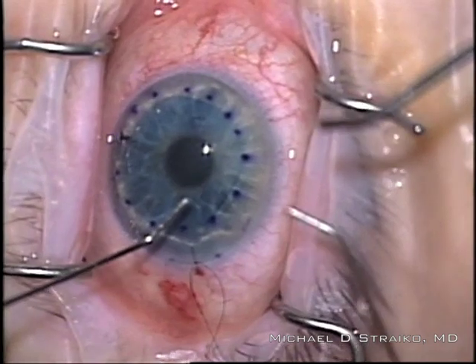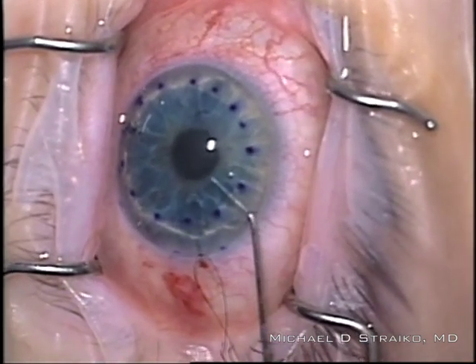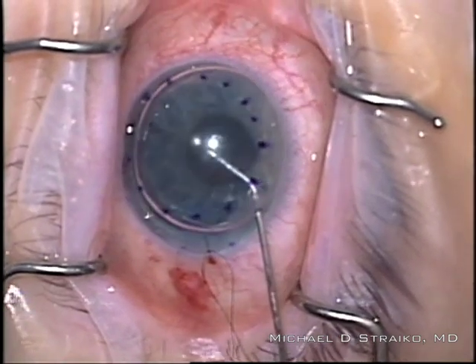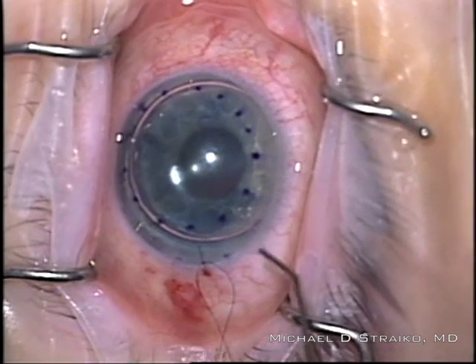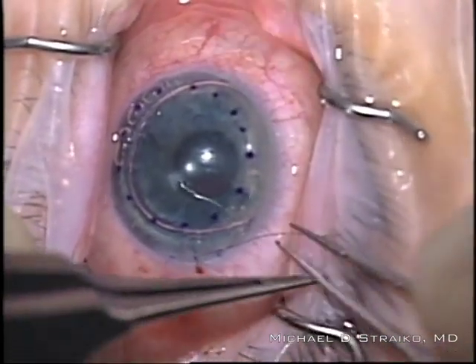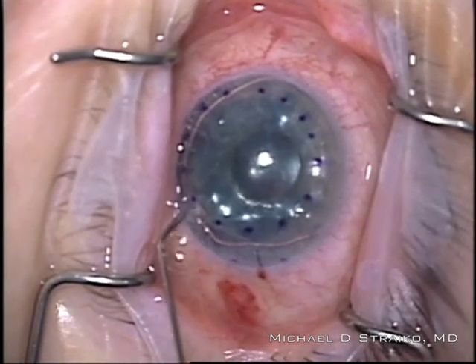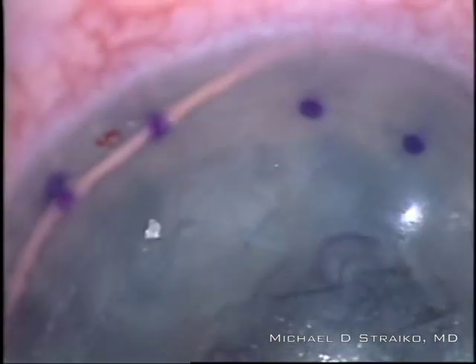Now that I have it in good position, I'm going to carefully get a cannula with 20% SF6 gas just under the graft and above the iris — careful not to touch the graft — and slowly inject a bubble, then fill the anterior chamber with SF6 gas to hold the graft in position. I elevate the pressure and leave it elevated for about 2 minutes at a fairly high pressure. I then go ahead and permanently tie my slip knot, rotate and bury it, and leave the eye at a higher pressure for 2 minutes, then reduce to a more physiologic pressure. I aim for a pressure of around 20 for the next 8 minutes, leaving the eye fairly undisturbed.